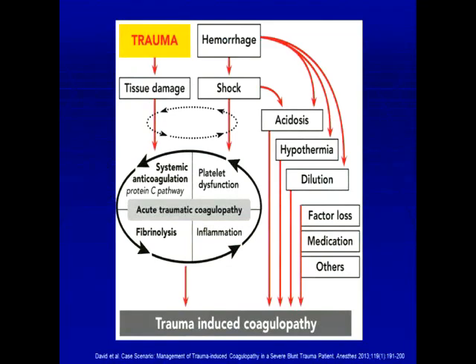So as you all know, in trauma, coagulopathy is one of the deadly triad. And more we're recognizing that the issues in trauma-induced coagulopathy start with coagulation factor deficiency, consumption of fibrinogen, and then you get that hyperfibrinolysis effect, which Crash 2 really brought to the forefront. And so ROTEM can help with all three of those issues that allow you to get on with early management of trauma-induced coagulopathy.